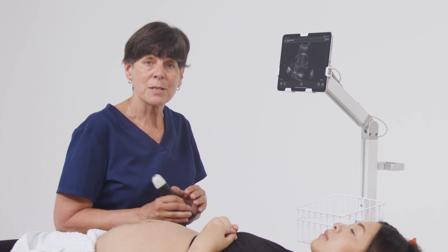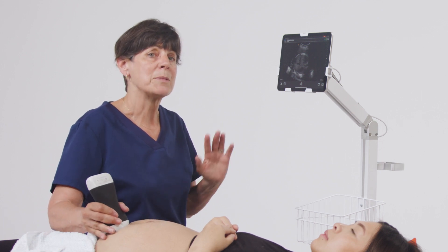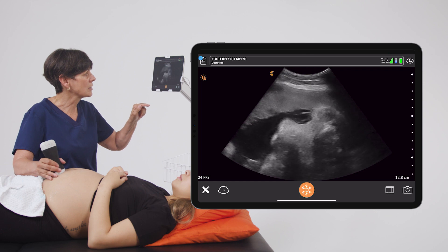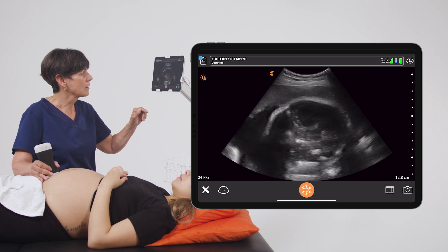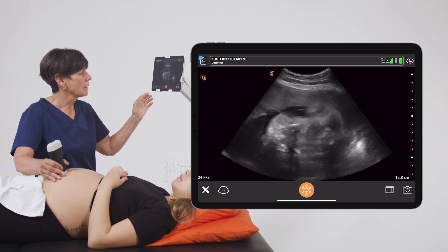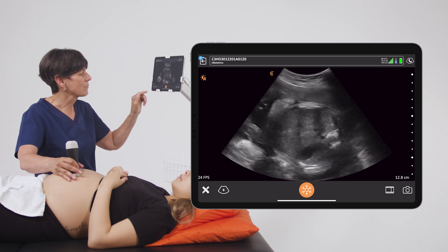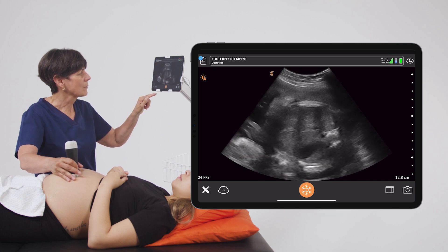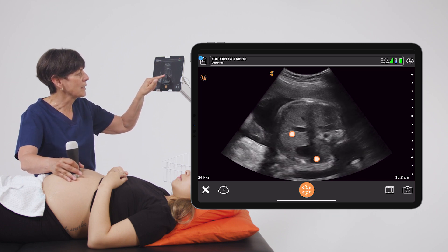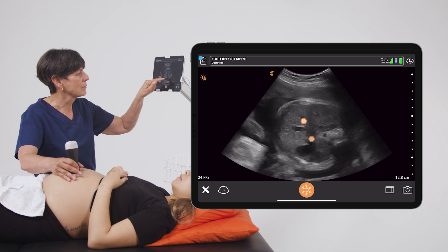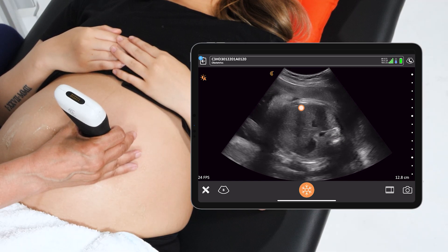Once you've determined the position of the baby, you'll want to obtain a nice cross-sectional image through the fetal abdomen that shows the stomach, the umbilical vein, and the portal sinus, which is this L-shaped structure.